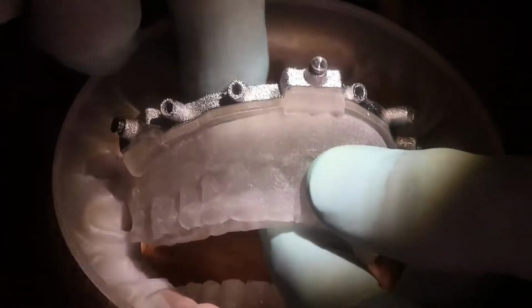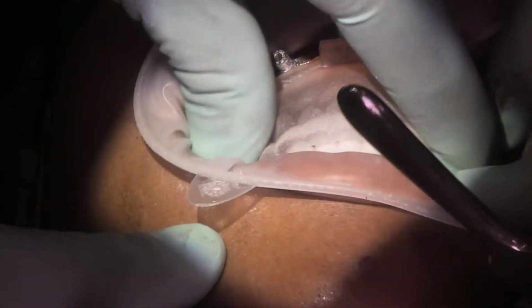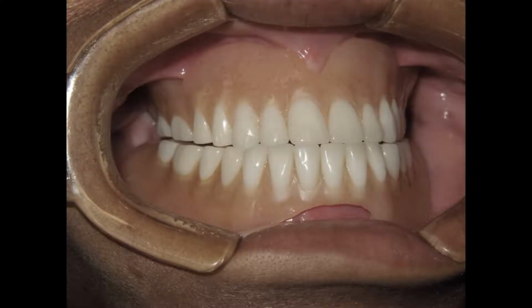The pin guide is a soft tissue supported guide and must fit the tissue intimately, and the occlusion must be exact. The successful outcome is a result of the pin guide fitting exactly as the patient's existing dentures or new dentures fit. It is critical that the steps are followed for surgical and restorative success.